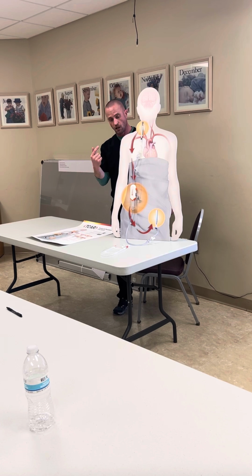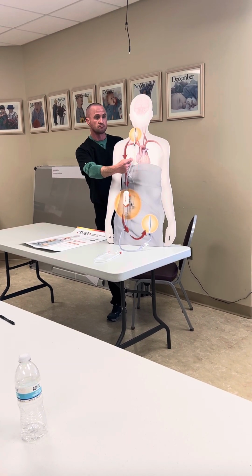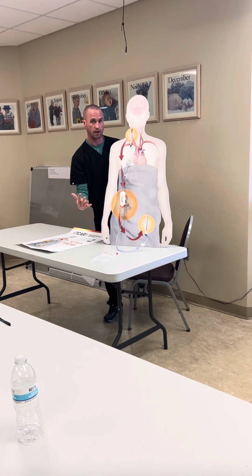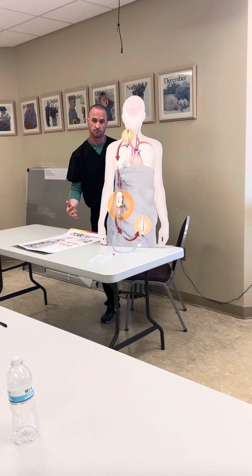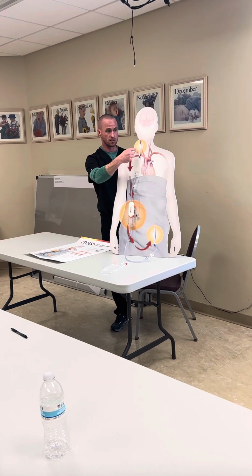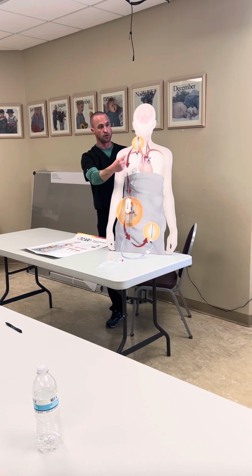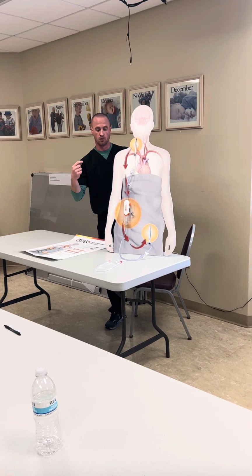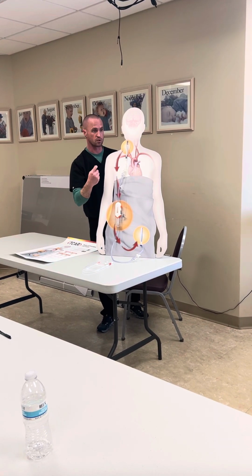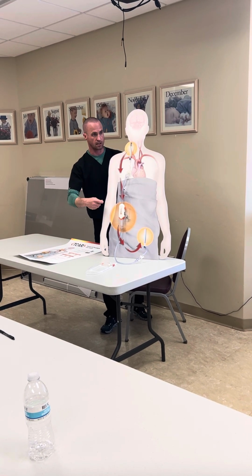So steps, I'll go through those pretty specifically. Again, cut down. Usually Dr. Reiser does his femoral venous access first. Kind of gets that out of the way, unless he has ultrasound issues, and then he waits on ultrasound. But usually he's femoral venous access, and then he does his cut down. And then once those things are ready, we'll basically go to put the sheath in. C-arm will come in, we'll do our micropuncture access, we'll put the sheath in over an 035 J-wire, which we provide. Once the sheath's in place, he'll basically connect to the tubing.